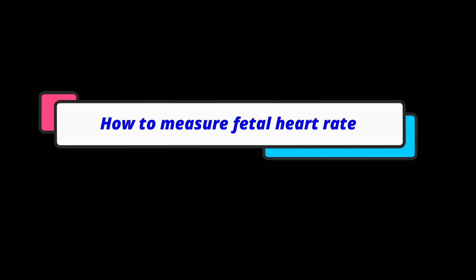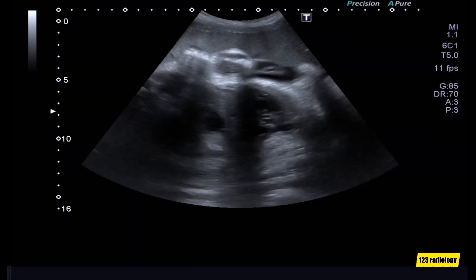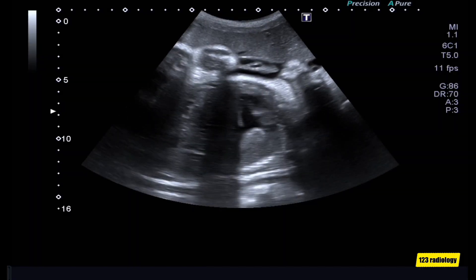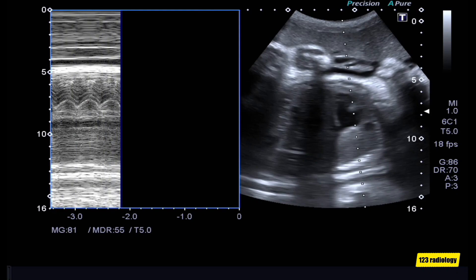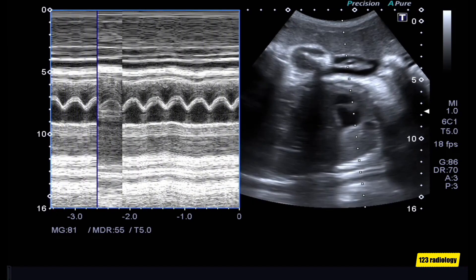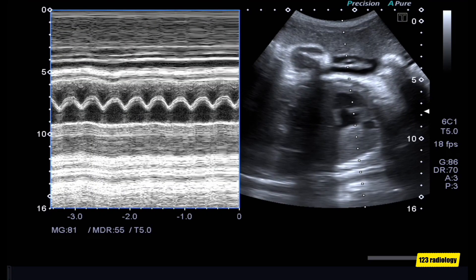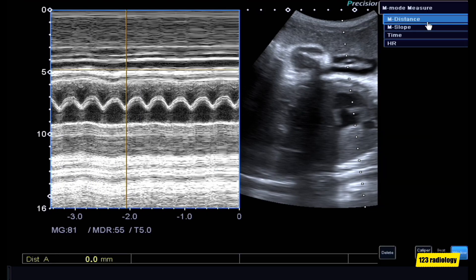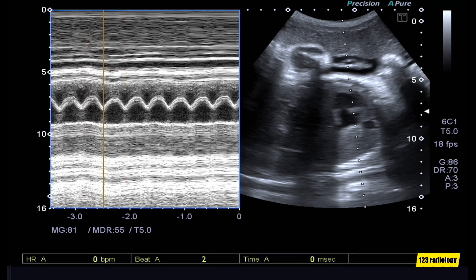How to measure fetal heart rate. First, focus on the fetal heart. Then activate the M-mode. The fetal heart should be positioned to the sonographic marker and the heartbeat waves are visualized on the screen. Freeze the image. The distance between the peaks can be marked and the machine counts the heart rate, which is displayed directly on the screen.